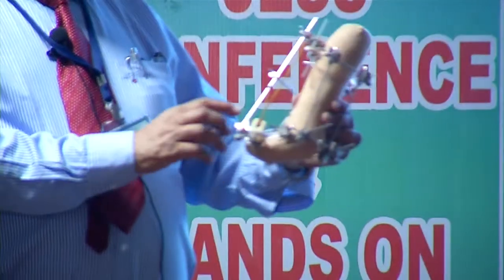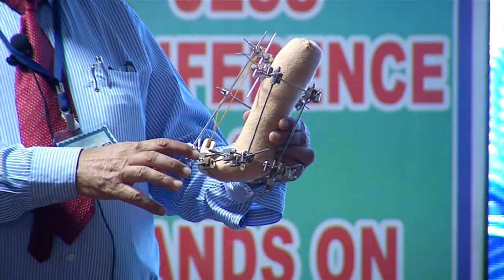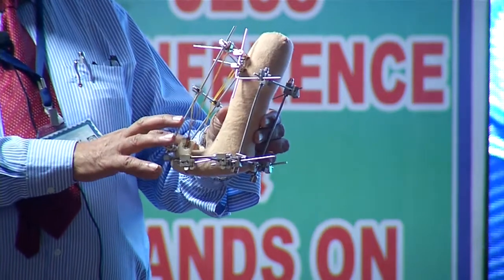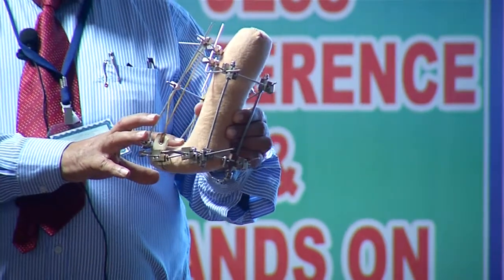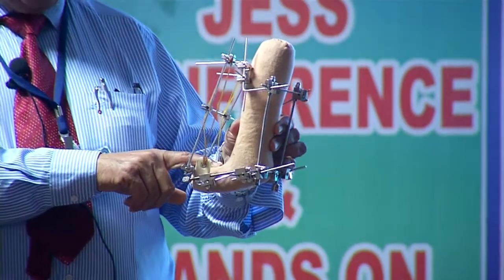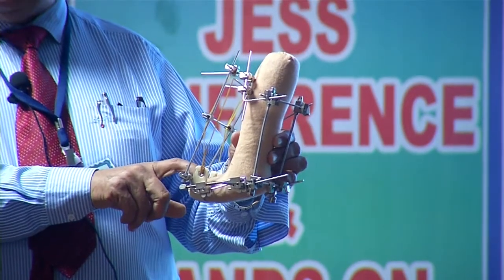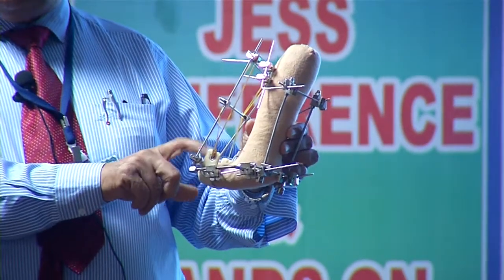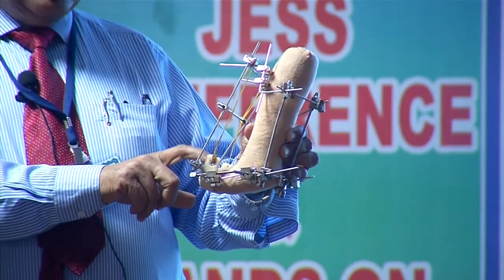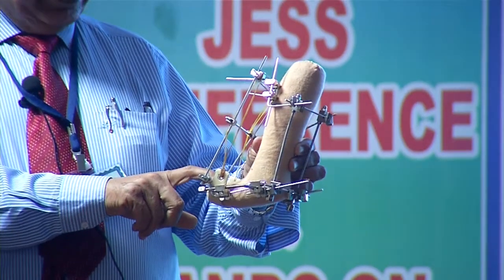Insert two K-wires in the metatarsal from the medial side as well as from the lateral side. Use two half pins on the medial side and two half pins on the lateral side. You should not impair all the metatarsals and must respect the arches of the foot, otherwise the patient will end up with deformity of flat foot and the arches will be lost.